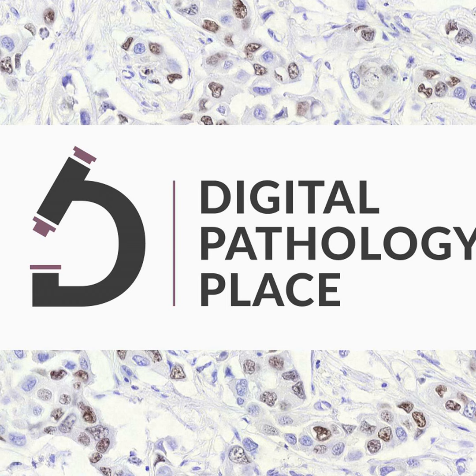Of course, there are tricks that you can do to work around this. So we've done this for mitotic counting, where you use immunohistochemistry as a sort of surrogate reference standard, but you cannot do that for every task. And it's more expensive. You need to go back to your tissue blocks, you have to restain, you have to register. So a lot of other complications come up. But this is an alternative to pathologist-based annotations, though still fully supervised learning where you need to annotate everything. Only here the human burden is a bit less.